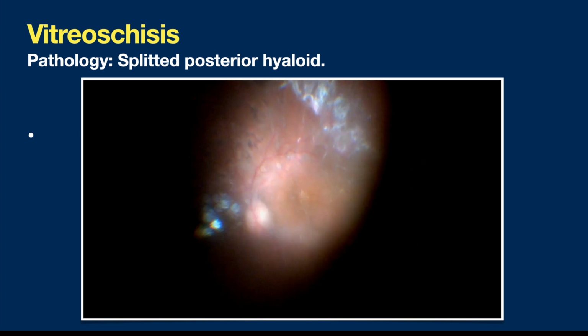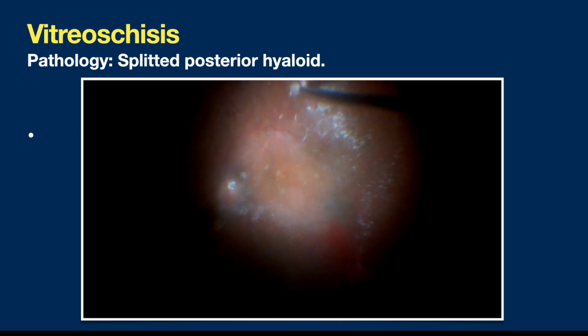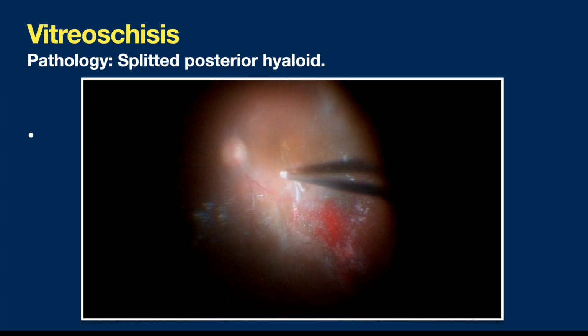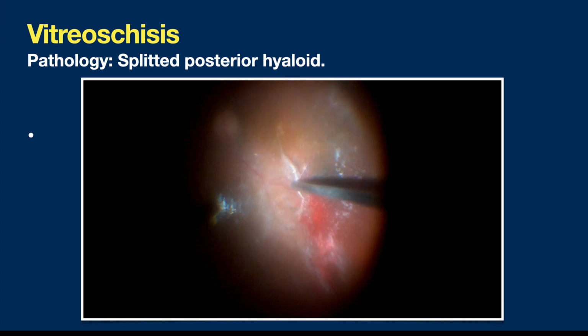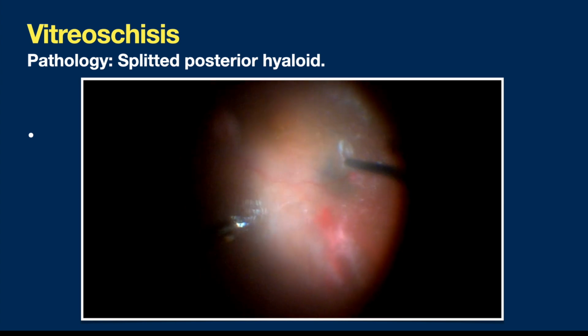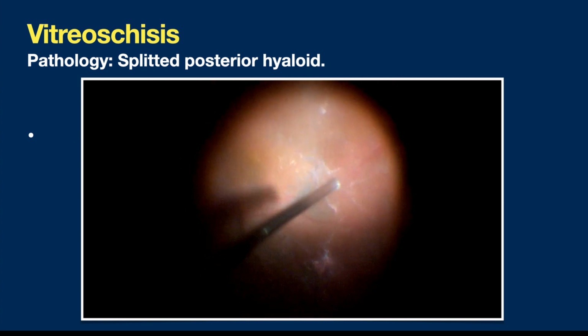I prefer staining with triamcinolone late during the surgery, if I feel that I finished everything, so that if there is a separate layer of vitreous adherent to the retina, it should be addressed during the surgery.